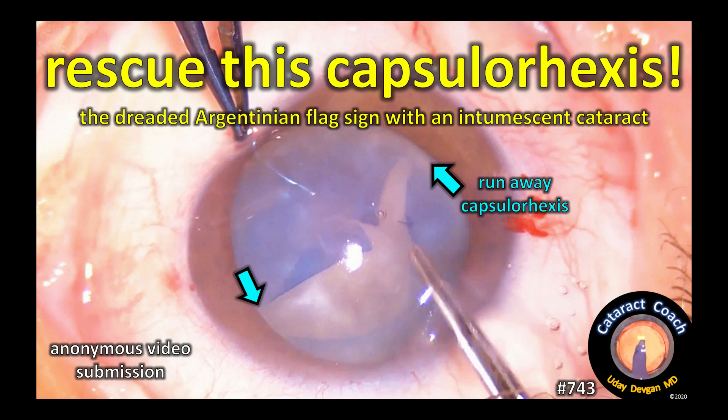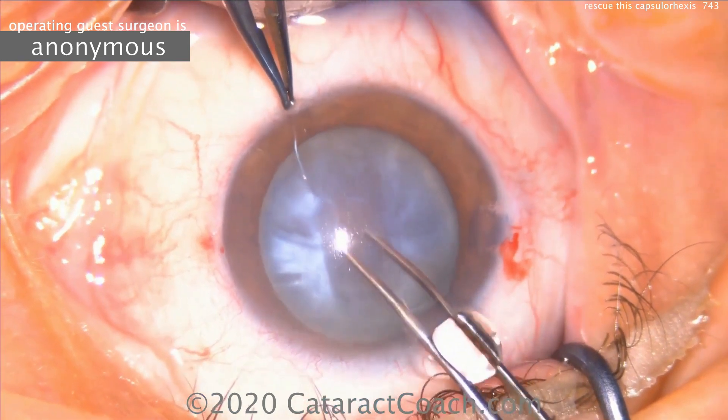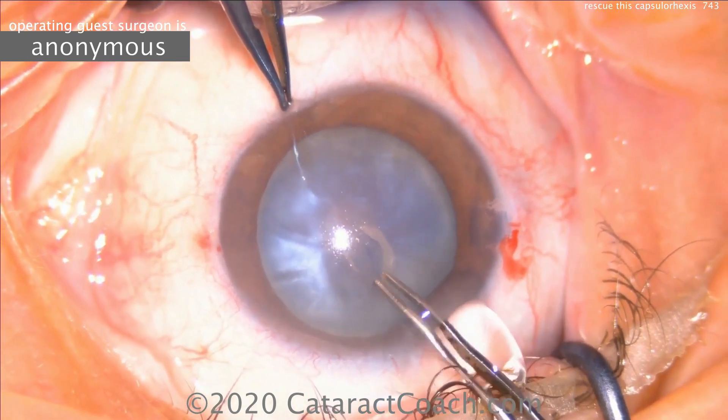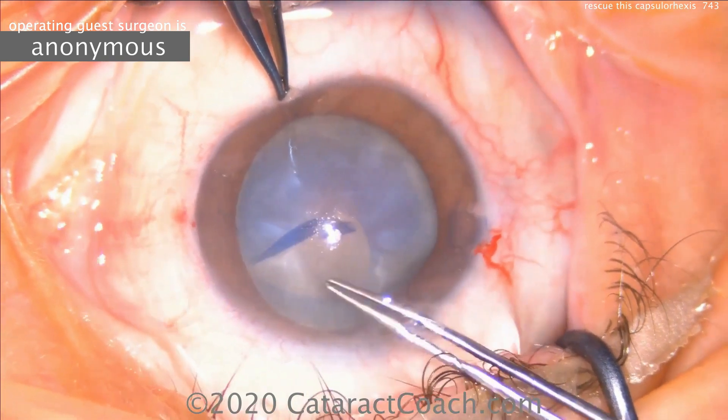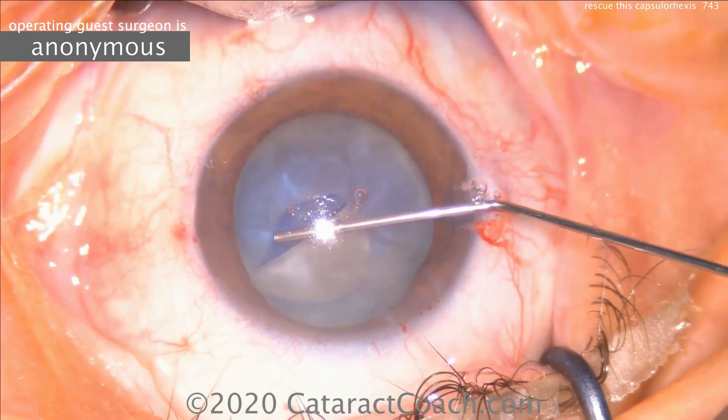CataractCoach.com. Rescue this capsulorexis. Here we have the dreaded Argentinian flag sign. This is a patient with an intumescent white cataract. The phaco incision has been made, forceps are being used to go inside and start the capsulorexis, and you can see it wants to run out because there's a lot of pressure.